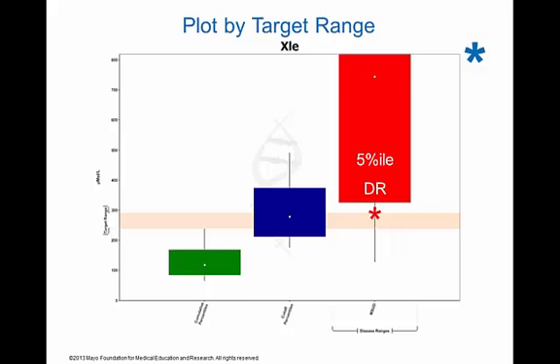This choice, rather than either the lowest value observed for a given condition or the first percentile of the disease range, is necessary because virtually in every condition there are highly unusual cases with normal or even lower than normal results. These cases would be missed by any cutoff value for isoleucine-leucine a lab would choose, and any attempt to identify them would trigger unmanageable numbers of false positive cases. The interval between the two levels is what is called the cutoff target range.